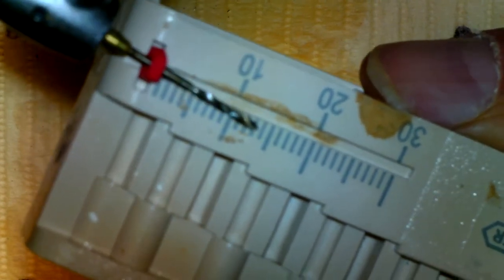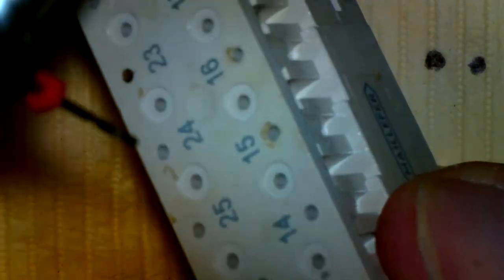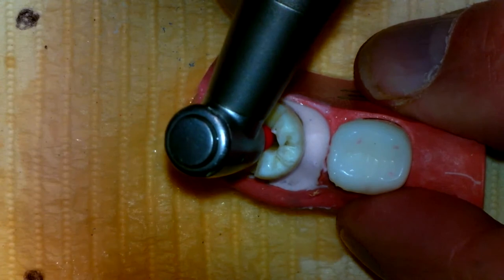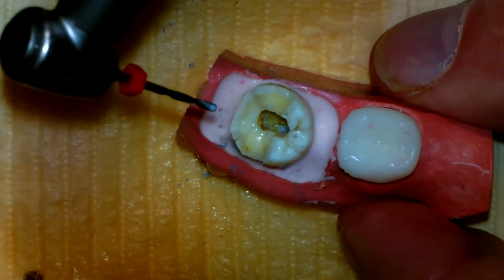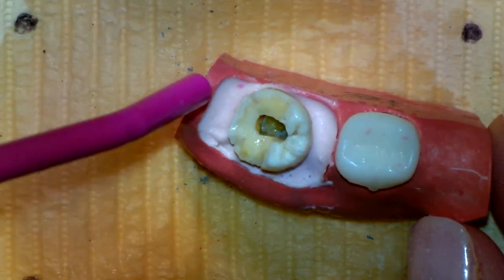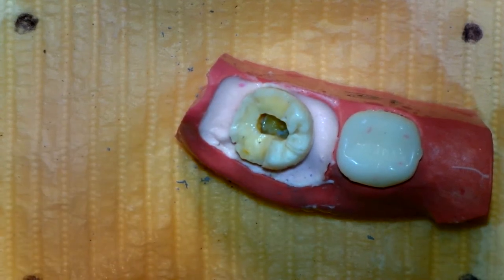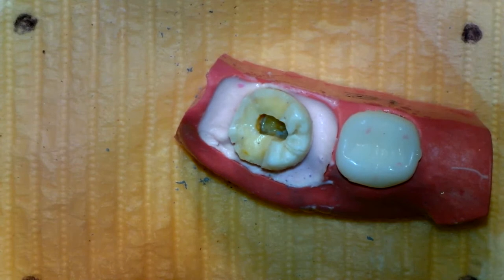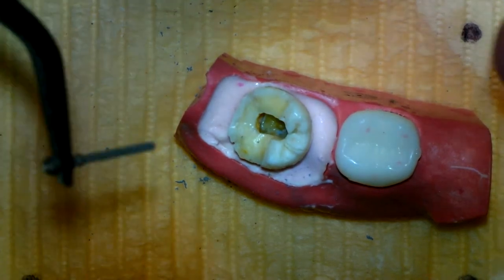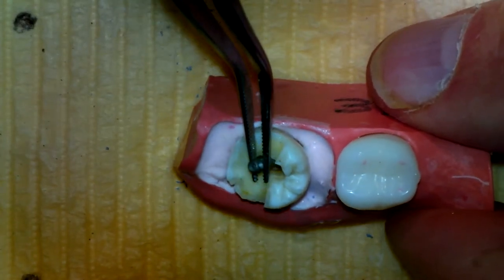I'm at 14 millimeters. I can also just set it in at 14 and go down into that distal root again. It goes down and actually has resistance there, so I'm probably in a little bit of a curve of the tooth. That was a size 4½ post. So now I'm going to take a 4½ post out of the hot box and fit it down into the canal.